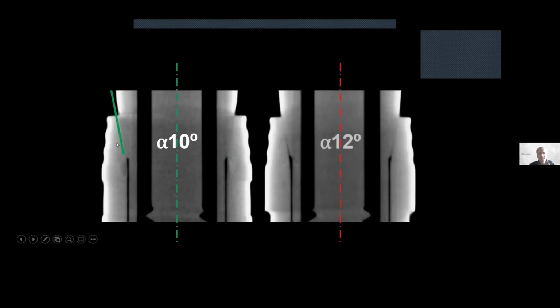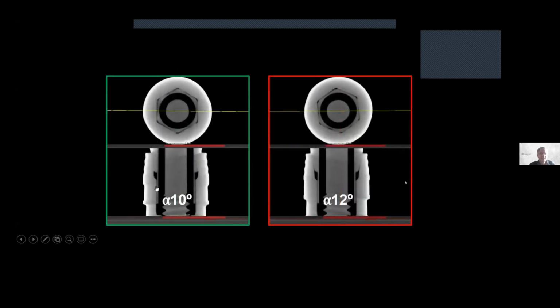with a perfect sealing. And when you don't use the original components, what we have seen is that in many cases, it's about 12 degrees, and you will see what happens. This is the 10 degrees, and this is the 12 degrees. Have a look at that part of the connection. Perfect sealing, okay? So there's no microfiltration of the bacteria. And have a look at this.